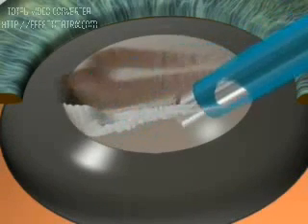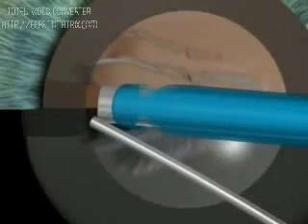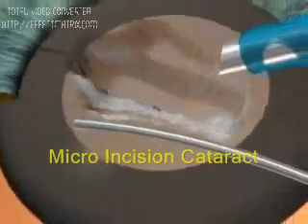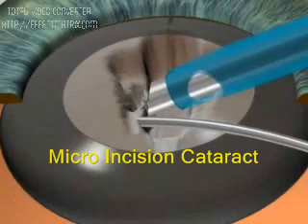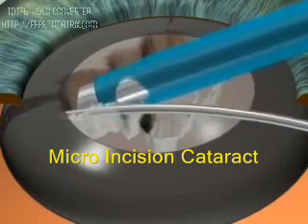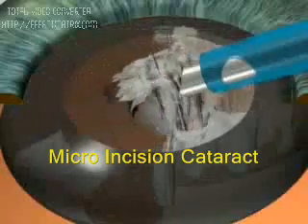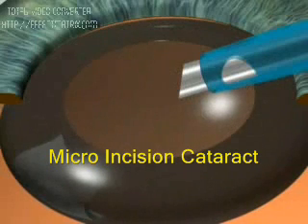The instrument tips move deep into the trench, and the lens is cracked. The cracked lens is then rotated and cracked again until 4 quadrants are left. Care is taken not to puncture the thin posterior lens capsule, since that could result in a prolapse of vitreous.